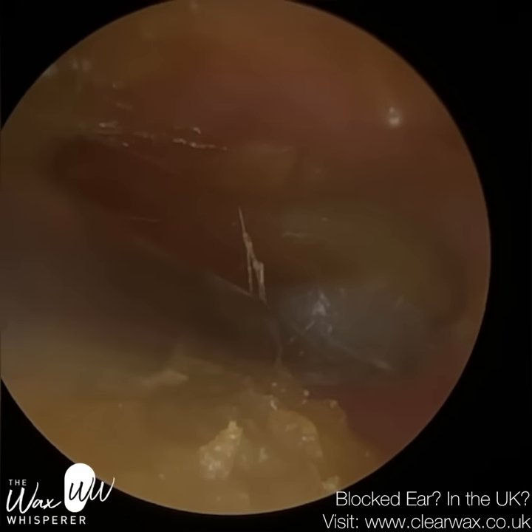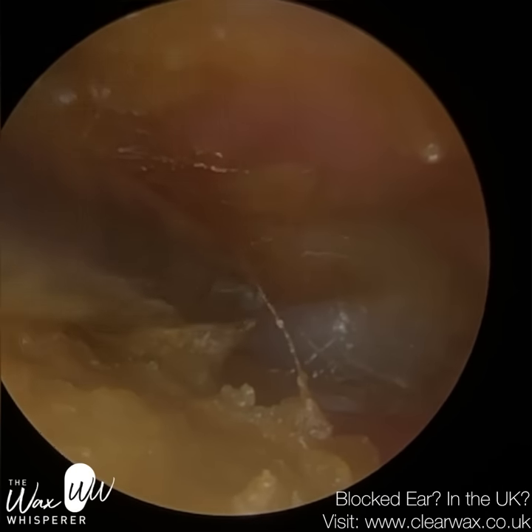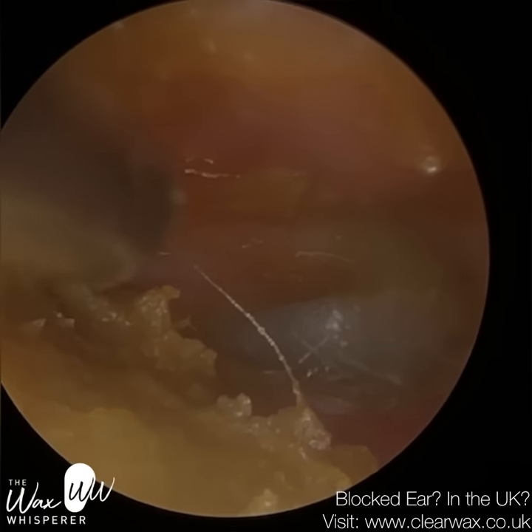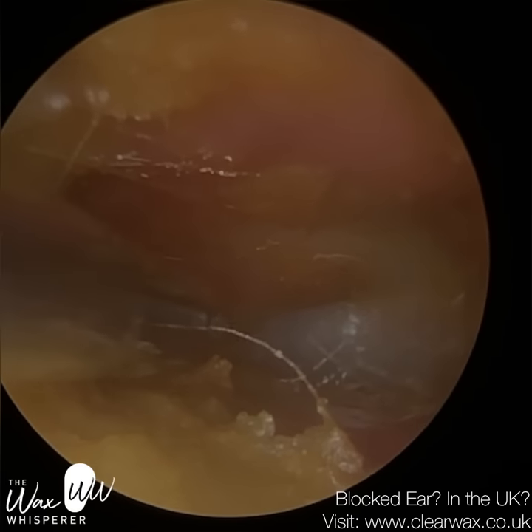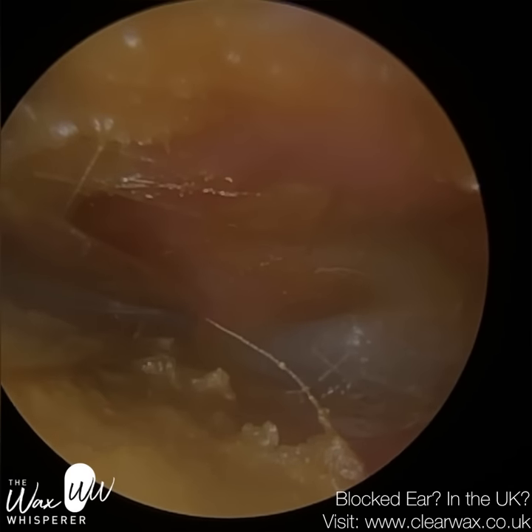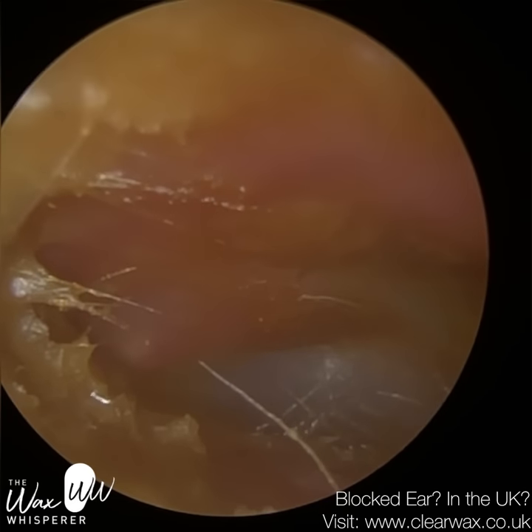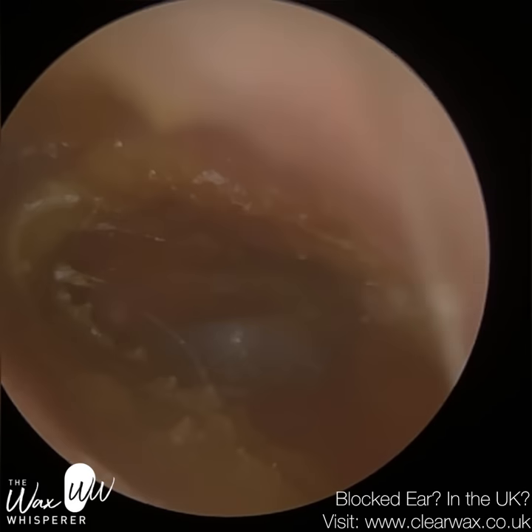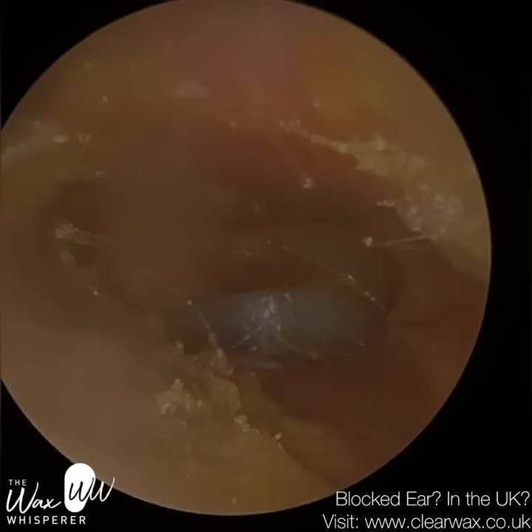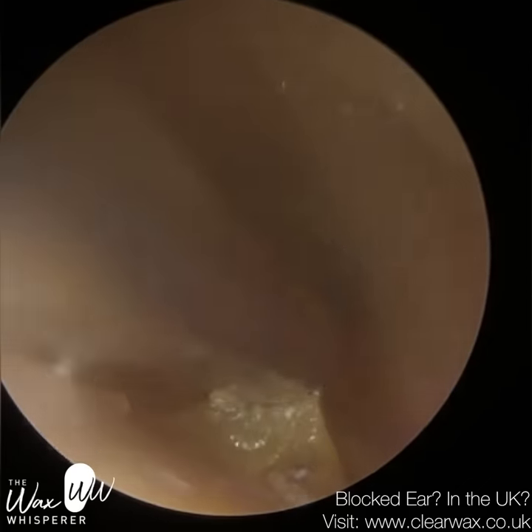So the Wai double-ended ear hook, also the Wai double-ended ear curette — similar to a Jobson horn, but I've modified the shape and architecture of the spoon at the end. Even the ear hook is different to the normal ear hook — I've just modified that to make it more effective. I've also introduced a new product called the Wai ear pick, and again that's double-ended. I'm probably going to be using that quite a lot — I'm really excited by that one. And then I've got another instrument which I'll reveal later.